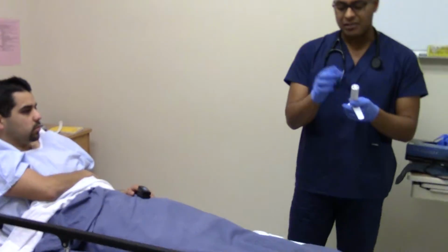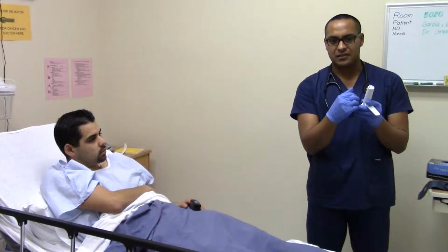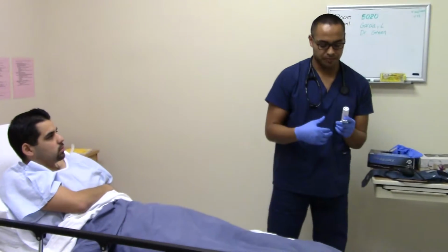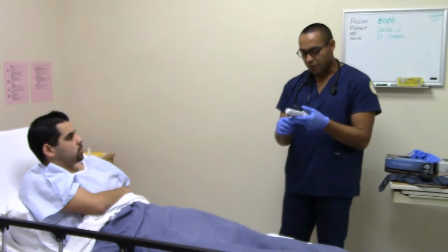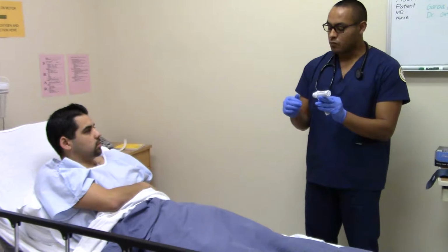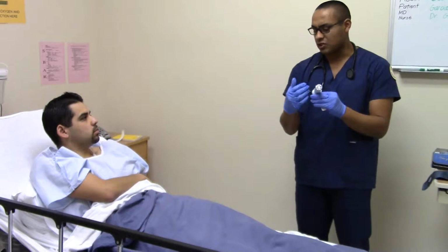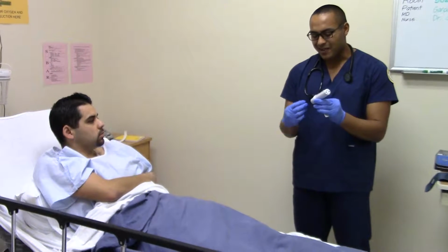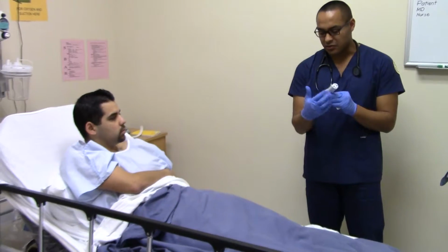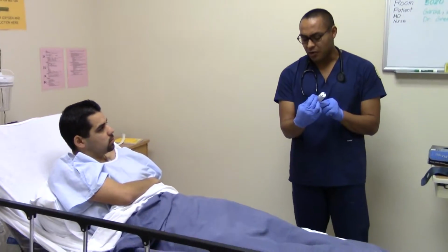Okay? And outside, I already adjusted the parameters for Christian's body weight and all that kind of stuff. And your height again was, Christian? Okay. So pretty much this. Now he can perform this. So Christian, what this is, it pretty much reads how strong your lungs are right now. I'm going to get your best attempt out of 3. Okay, so just breathe in, breathe out as strong as you can, and I want to see where you're at.